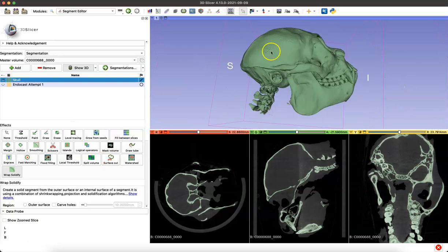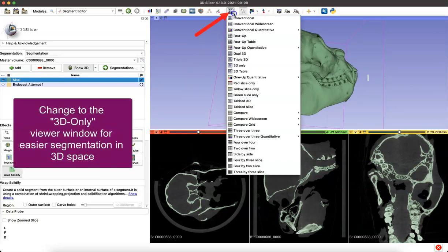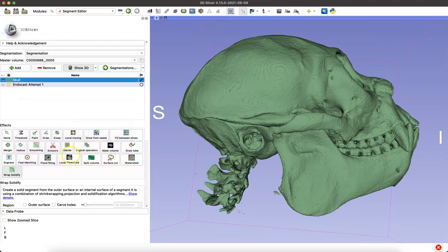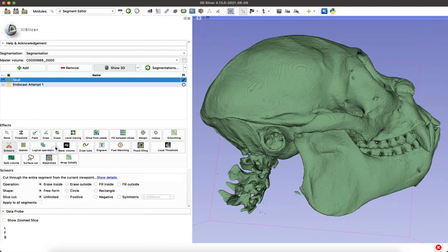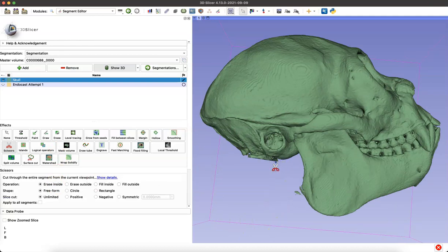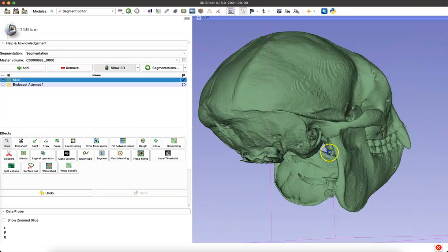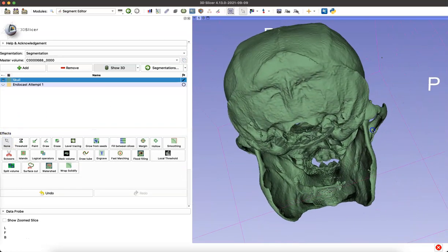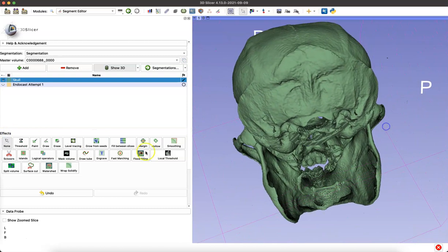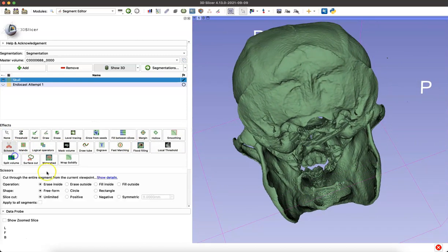Now we're just going to do some quick segmentation. It can be helpful to navigate to that 3D-only window so that you can do segmentation more easily. I'm going to be using the scissor tool, making sure it's set to erase inside. And I'm erasing all the vertebra up to the foramen magnum.